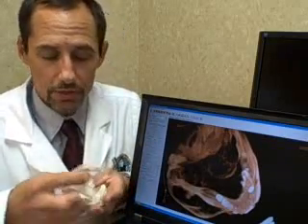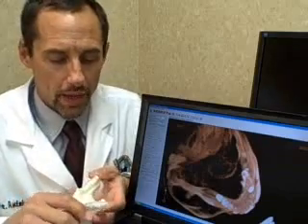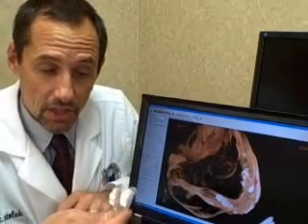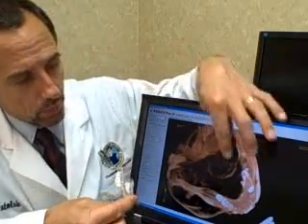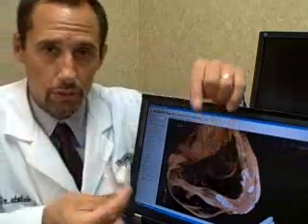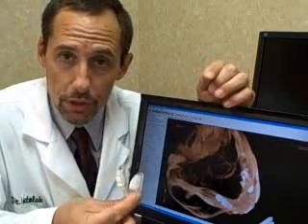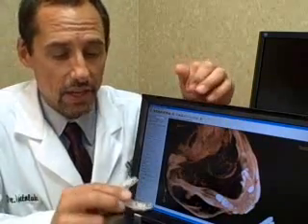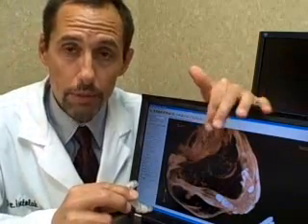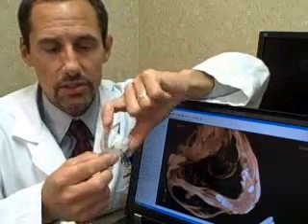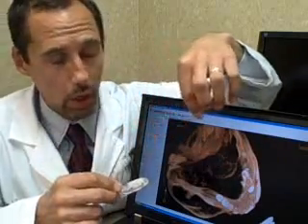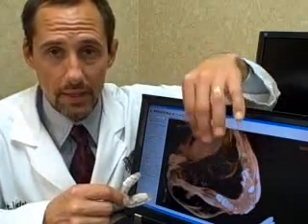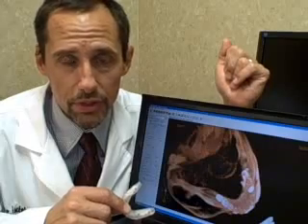We have an impression here of our patient's teeth. This device is made when the CAT scan is done — the patient wears this device during the scan, and the teeth you see on the x-ray are showing up from this. Once everything looks good and I determine where the implants go, we send this to a laboratory in Boston and they will mill out holes, computerized, according to the specifications I predetermined in the software.